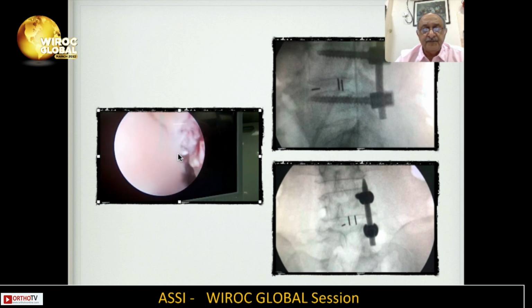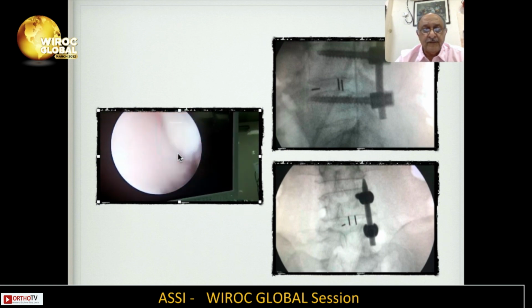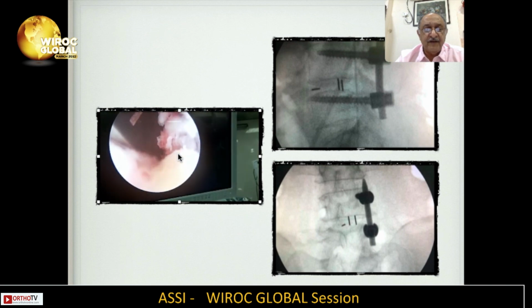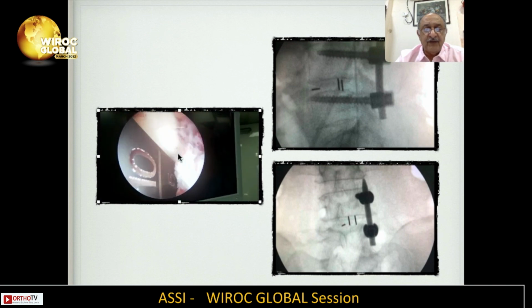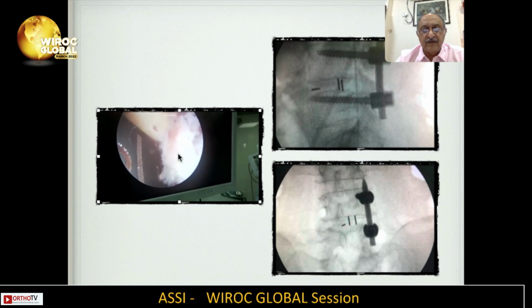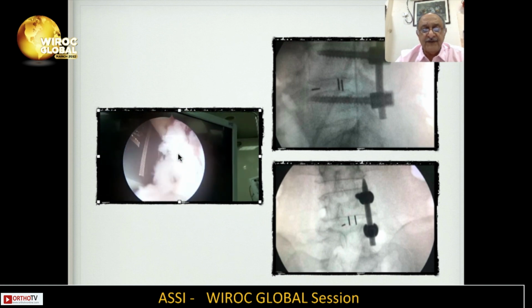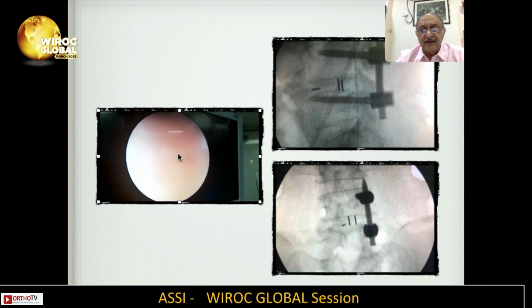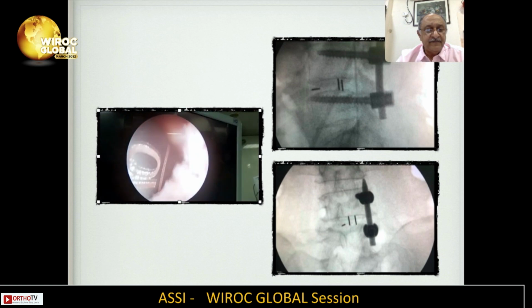And now the cage is finally getting seated. And we will be putting it into a depth of around 10-15 millimeters beyond the posterior edge of the vertebral body. Compressing ipsilaterally to make sure it doesn't back out.